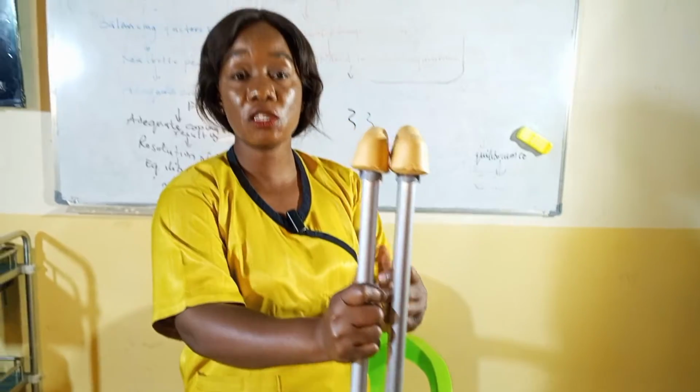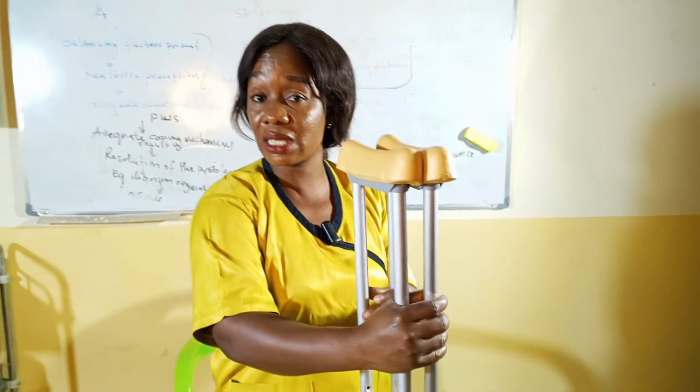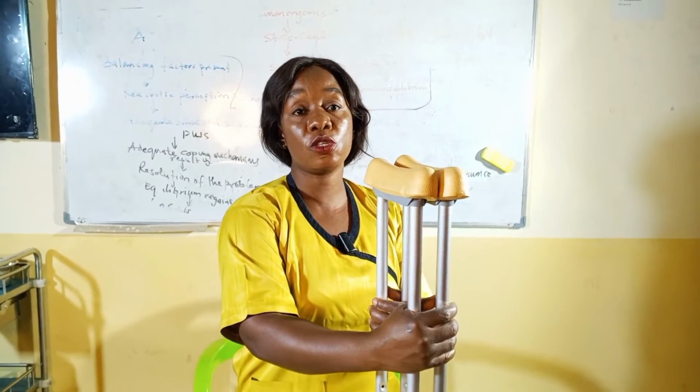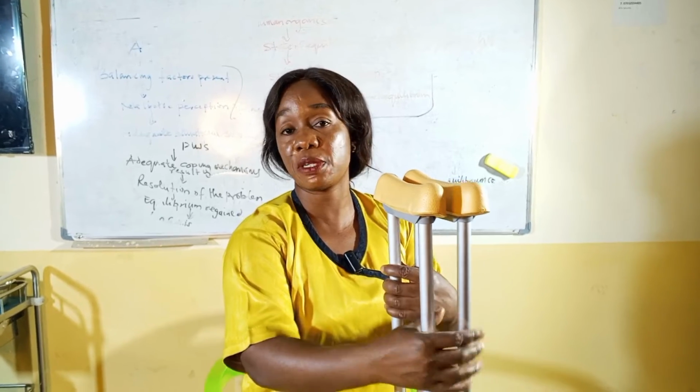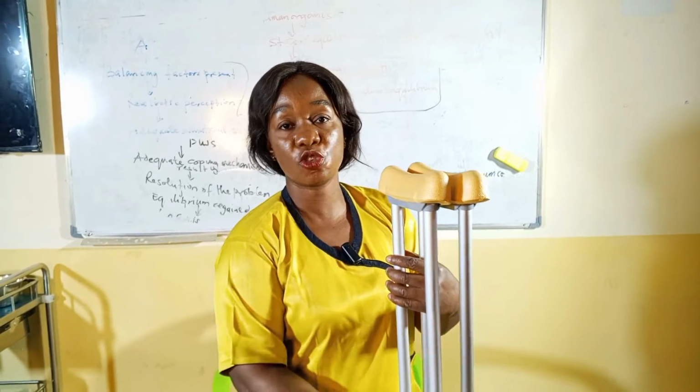So if you're going to use crutches and you're going to teach your patient, remember, it's just like a health education, when you are going to teach a patient how to use a particular instrument or how to prevent a particular disease. So you have to show the patient how to use these crutches.